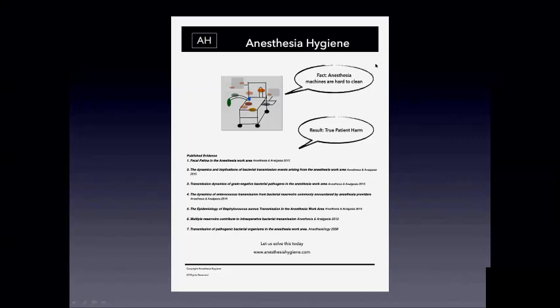These are places that get contaminated and are routinely missed during cleaning, because cleaning is effort dependent. It depends on the person administering or the availability of an anesthesia tech. So these two drapes pretty much keep the surface clean. You protect the machine from the patient's secretions. So the machine is clean, and when you have another patient, you don't transmit the contaminated secretions from the mouth or the nose to the next patient or to the IV port of the next patient.